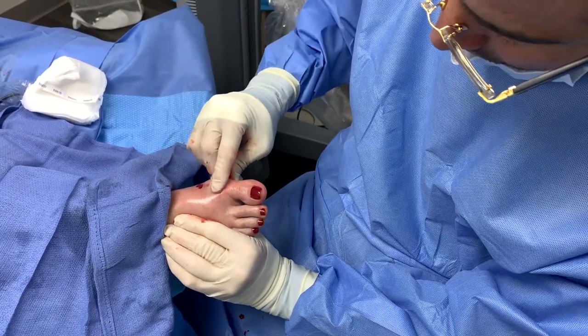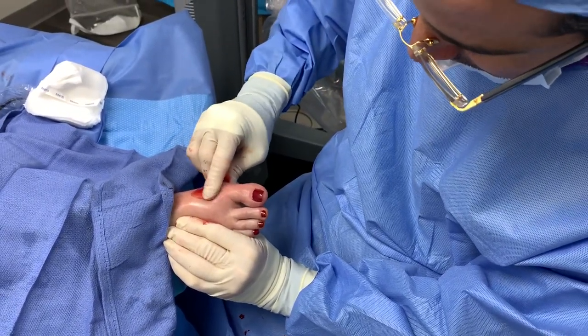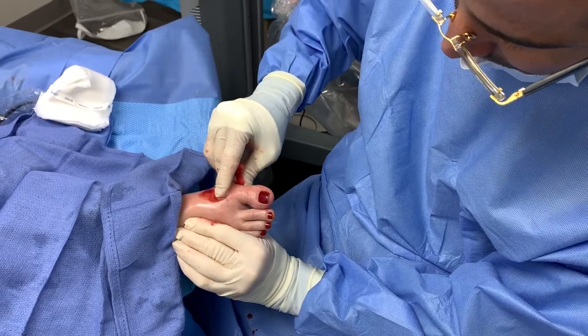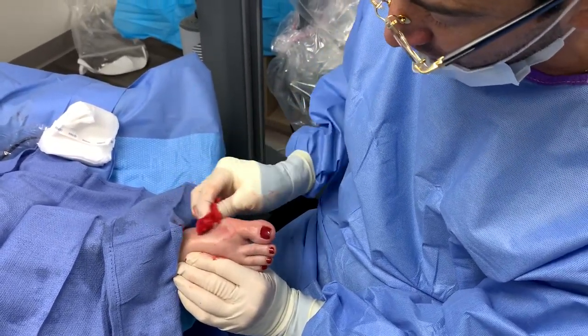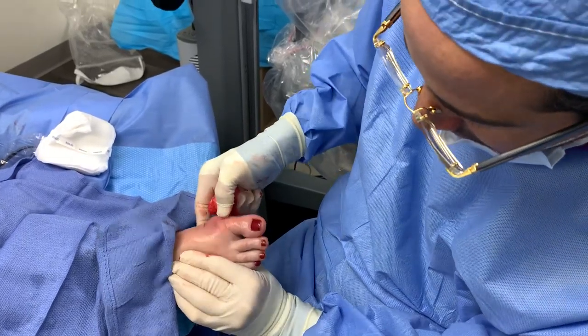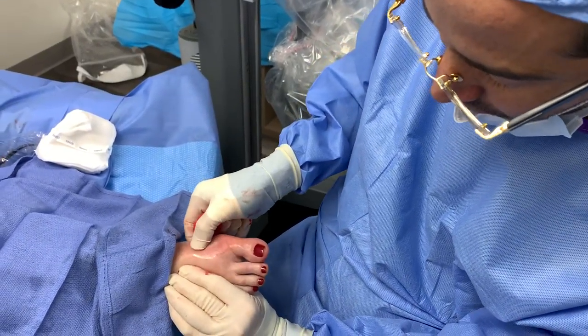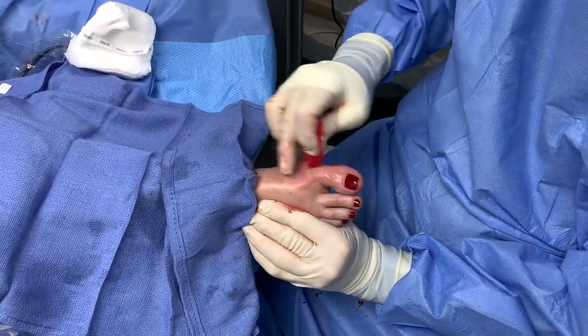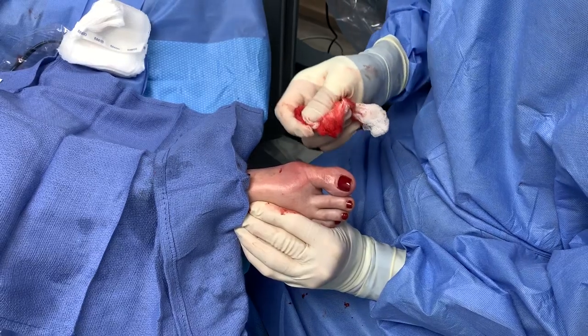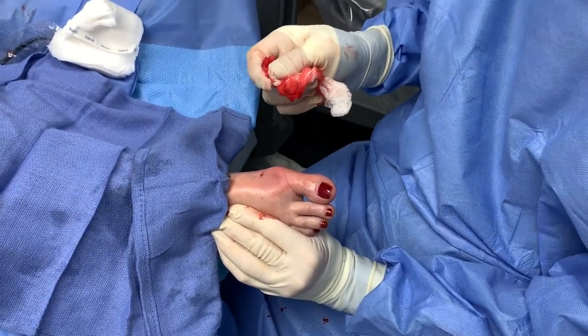I can already feel that there is no bone — we have already remodeled everything. There's a little dell here, and that is where the bone used to be. Now it's obviously gone, it's been pulverized.